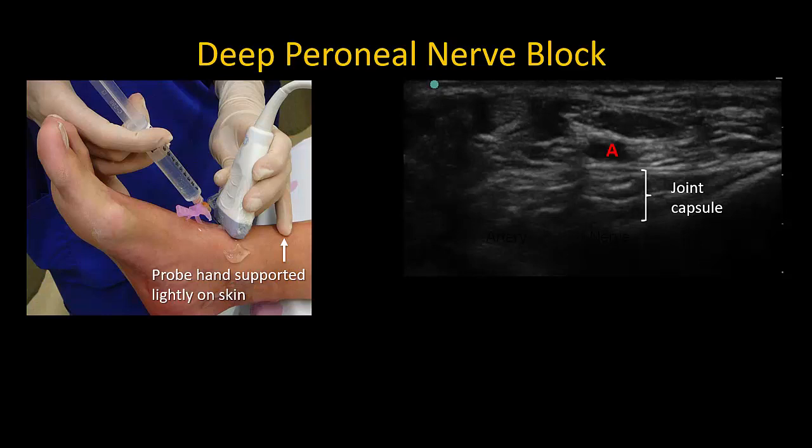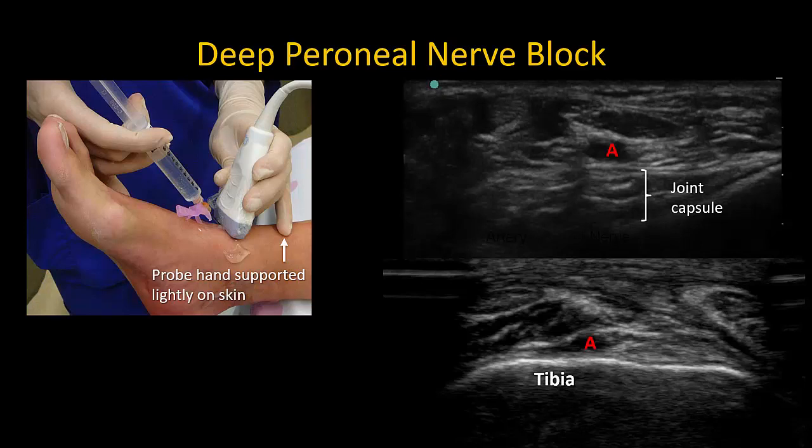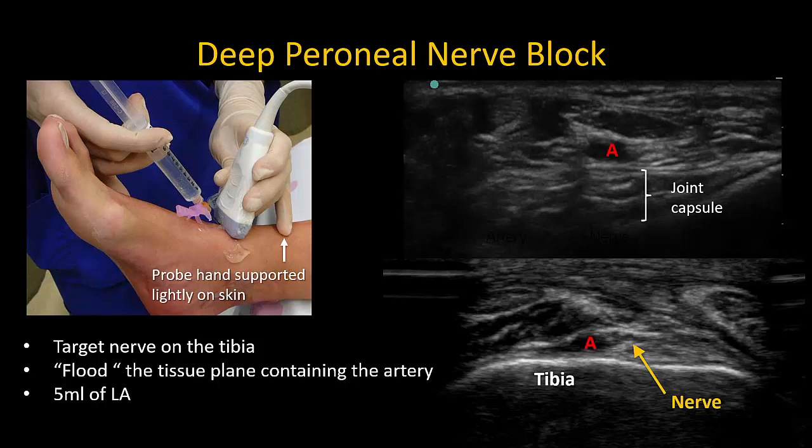The probe should be placed over the lower end of the tibia, proximal to the tarsal joint, and braced lightly on the skin to avoid compressing the artery. The upper ultrasound image shows soft tissue deep to the anterior tibial artery, which signifies the probe is held too low at the level of the tarsal joint. If you see this, slide the probe superiorly until the bony surface of the tibia is seen directly underneath the artery, forming a backstop for the needle and a floor to contain the injection. The artery is easily recognized by pulsation. The nerve is often seen on one side of the artery or above it; even if it cannot be recognized, it is easily blocked by depositing local anesthetic on either side of the artery in the same tissue plane.